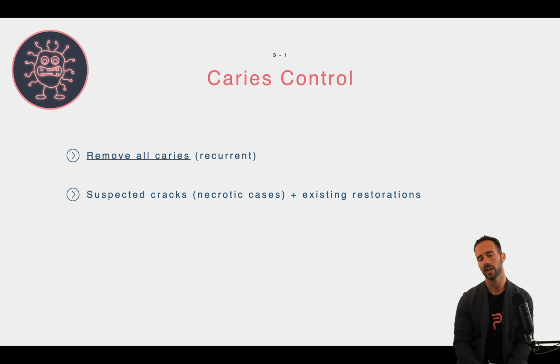All right, so you want to remove all caries before you initiate the actual endodontic procedure and get into the pulp chamber. Definitely not deep into the endodontic procedure. You want to make sure you have a clean area that you're working with. You don't want any of that bacteria in the carious lesions to get into your endodontic spaces where you're working so hard to disinfect that space and get everything nice and clean.